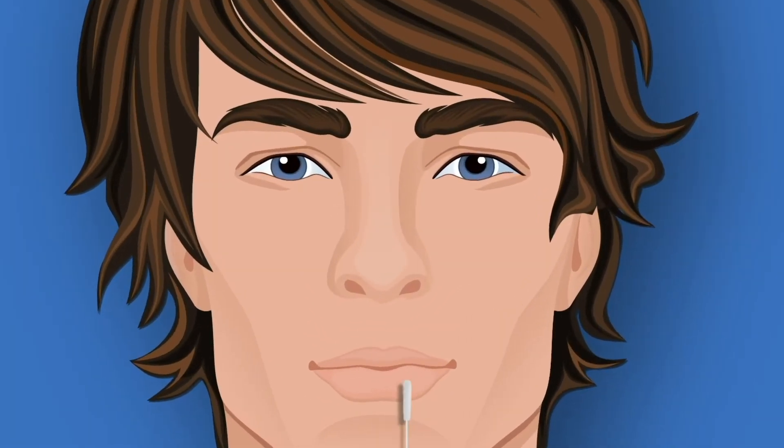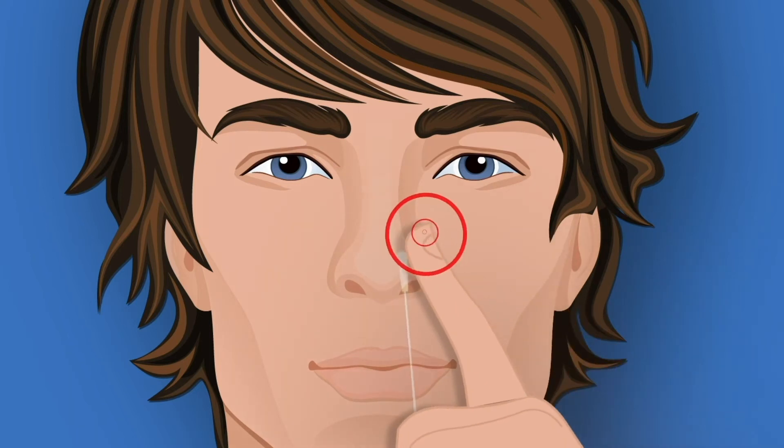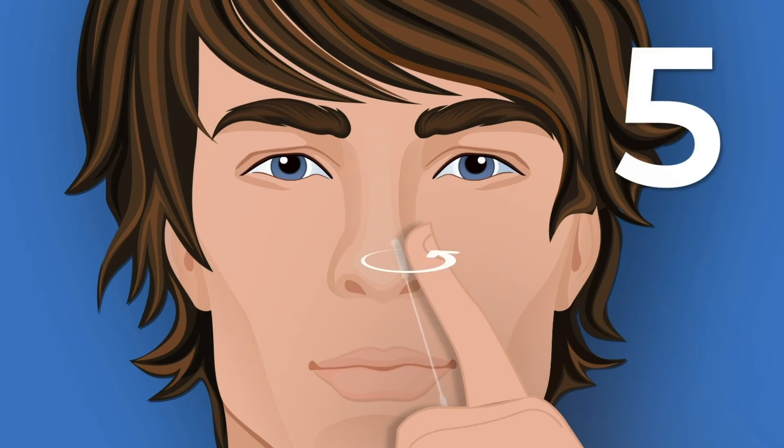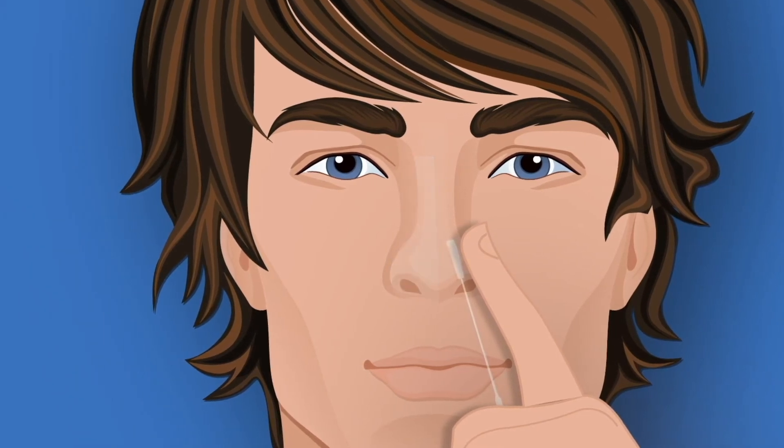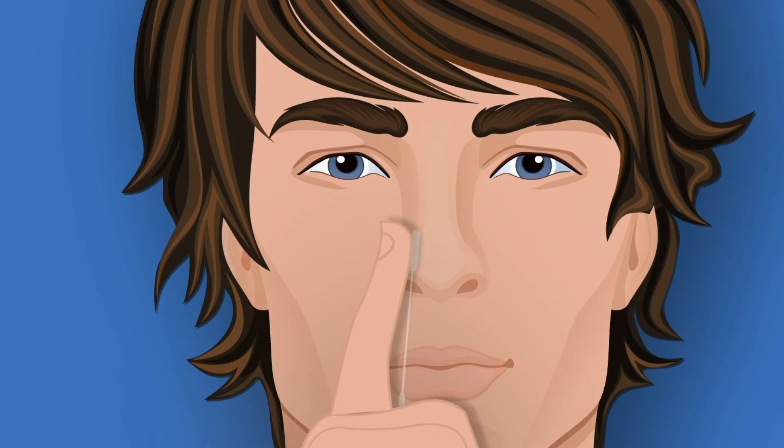Gently insert the entire absorbent parts of the swab into the nostril. Lightly pinch the nostril and twist the swab inside it, making five full turns. Repeat this process for the other nostril with the same swab.